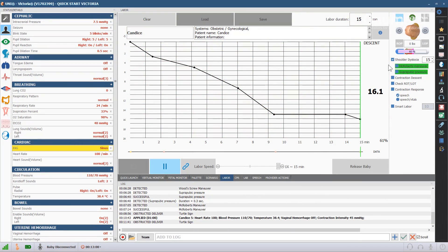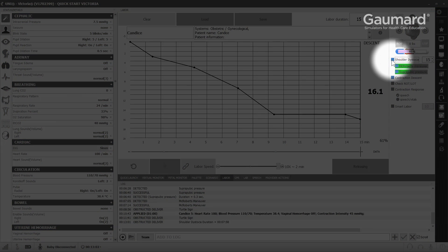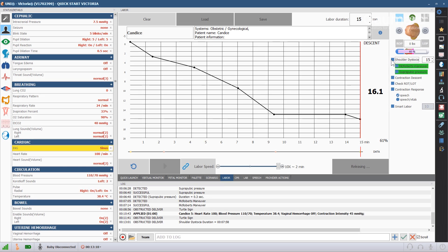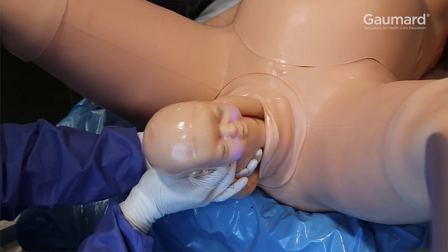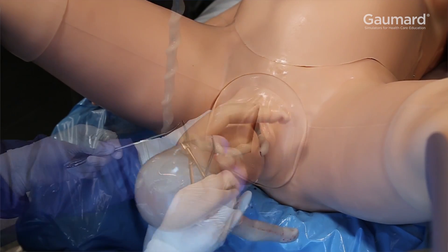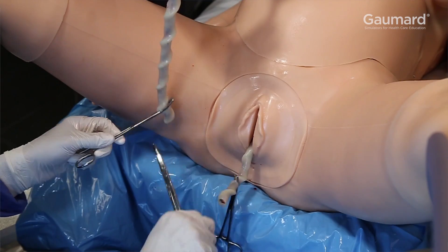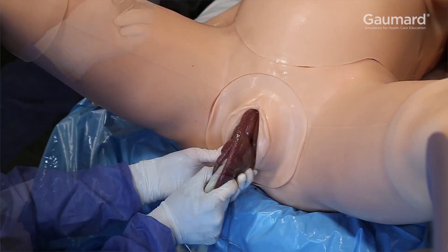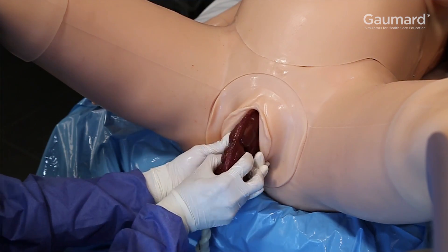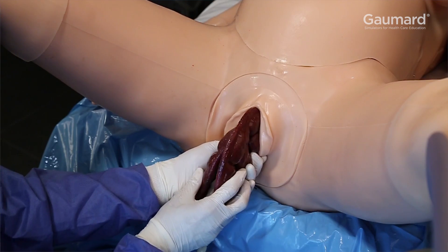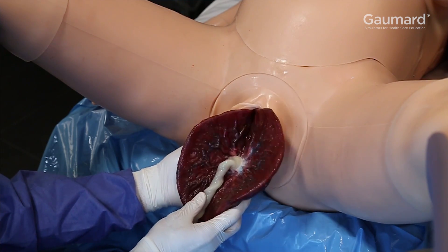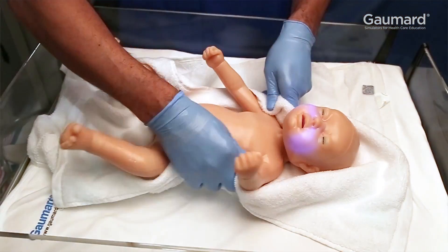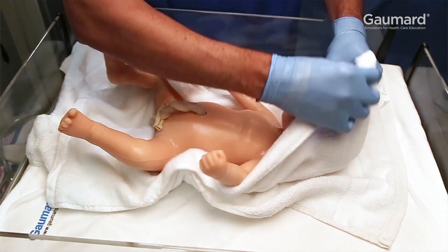To relieve the shoulder dystocia and allow the labor to progress, uncheck the shoulder dystocia box. Once the progress bar reaches the end of the labor graph, the birthing baby will unlock from the motor, allowing it to be delivered. After the baby is delivered, the umbilical cord can be clamped and cut, the placenta can be delivered, and the newborn can be evaluated for signs of neonate health.